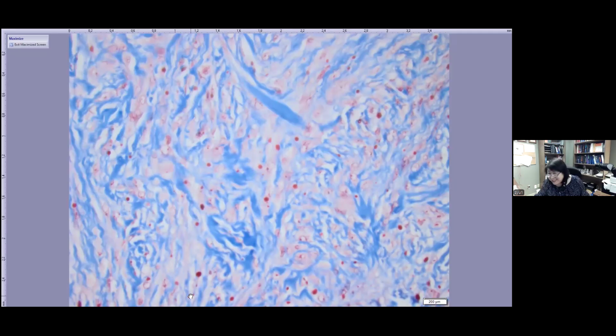So this is different from red blood cells. So very cute. If you see this, oh, I can make a diagnosis and you feel good. And inclusion body infantile digital fibromatosis also has a high recurrence rate. Sometimes they think they did excisional biopsy, but still have some residue, may come back, so just tell the surgeons that this is benign, recurrence rate is high.